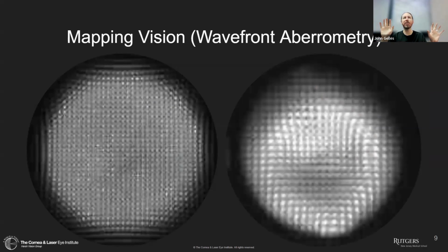All it can do is tell you that there is deformation or irregularity of the focus across the pupil coming from any of those ocular structures, right? And if you're wearing a contact lens, the contact lens just becomes part of the optical system of the eye to a wavefront aberrometer. So these things are highly sensitive, but totally non-specific.